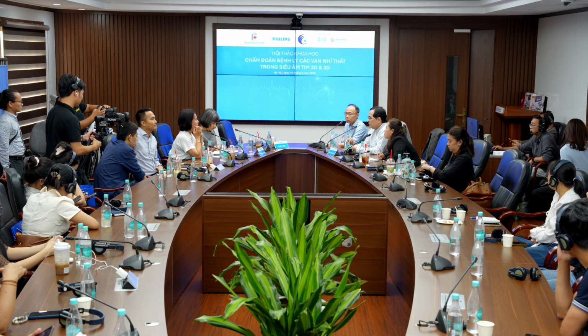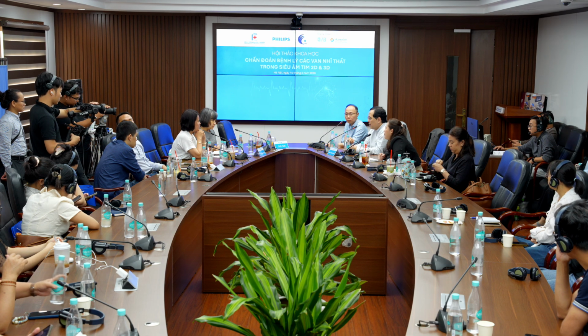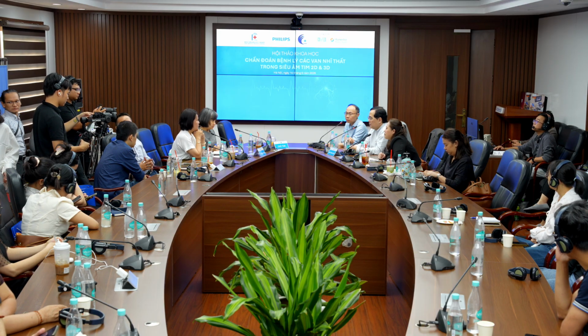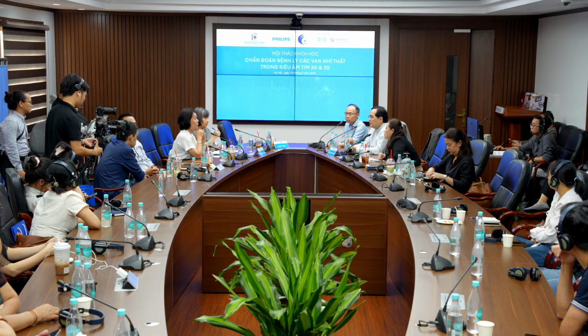But in terms of doing concurrently, I can remember that there was one severe MR and one pacemaker-induced TR, and we had to do it concurrently. But the procedure took a long time, more than 3 hours, with a lot of radiation and a lot of contrast, so not that ideal.